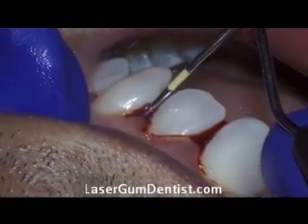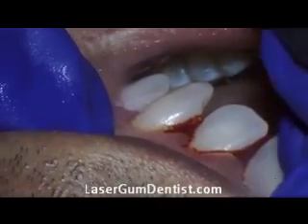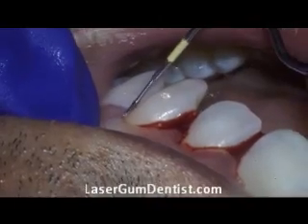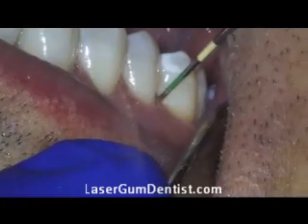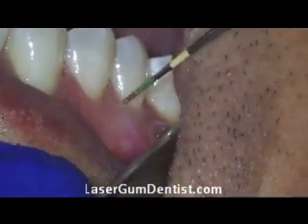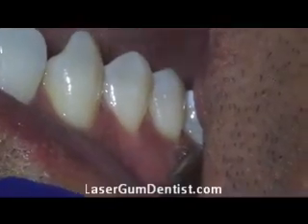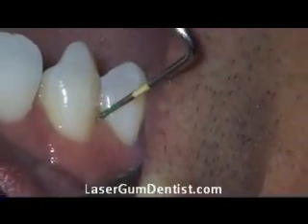What that means is the gum is regenerating. We're getting new cementum, which is new tooth structure on the root surface, and we're getting new connective tissue attachment. That's the way the gum is basically sewn onto the tooth. It is this attachment that holds the gum on the tooth.